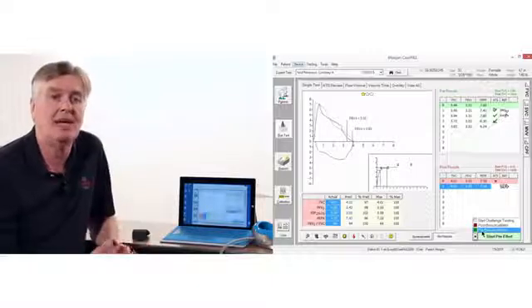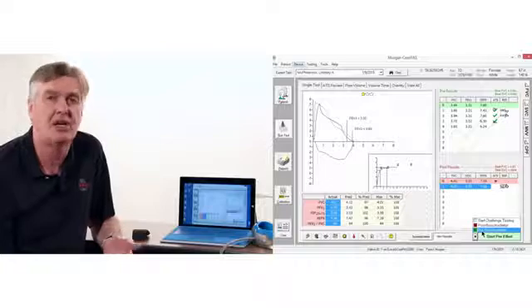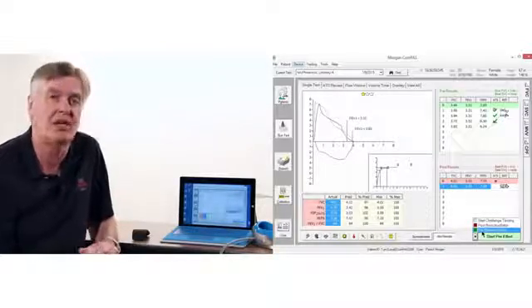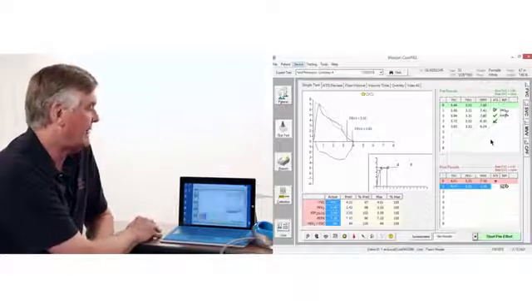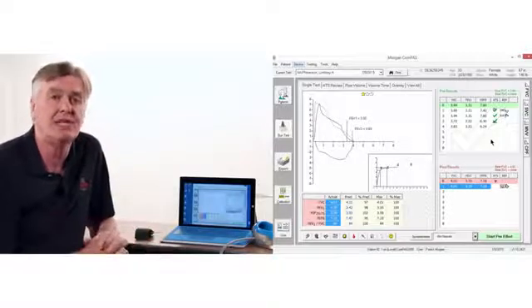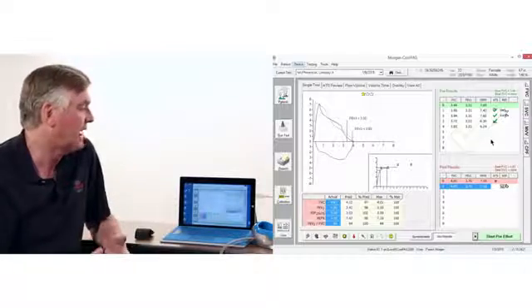This software will allow challenge testing for methacholine, aridol, exercise, cold air, any challenge protocol that you may have. The Pneumotrac, for a lot of people, that is pretty much all they're going to be using it for, flow volume loop, and we could end there.